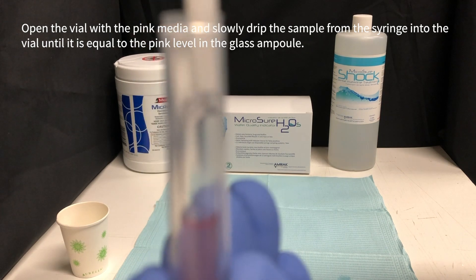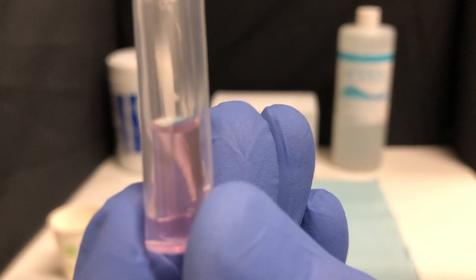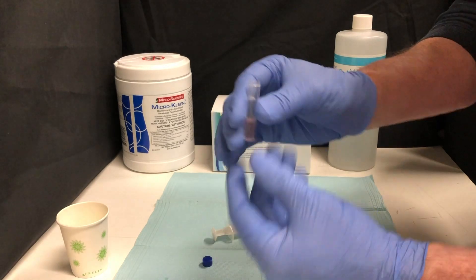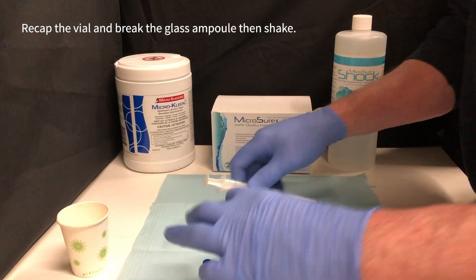Drip until the level is equal to the pink level in the glass ampoule. Recap the vial and break the glass ampoule, then shake.